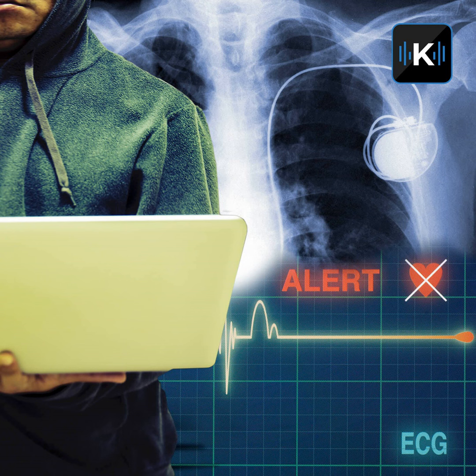The most important thing for you to know is whether your device is connected to a network. Being aware, of course, is the first step. You don't have to lie awake at night worried that someone's going to stop your heart while you're asleep. Just remember what Christian Espinosa said. The incidents are still very low. Okay, that may still keep you up at night, because if it's keeping you alive, it certainly would keep me up too. So what you want to do is ask your physicians.